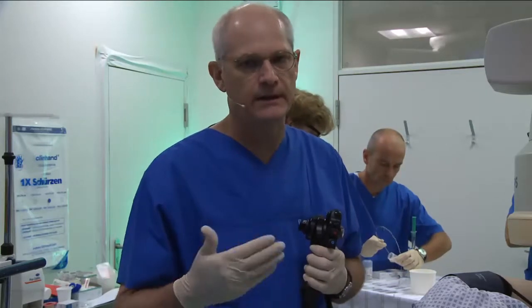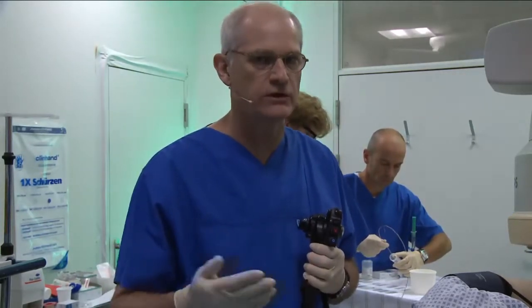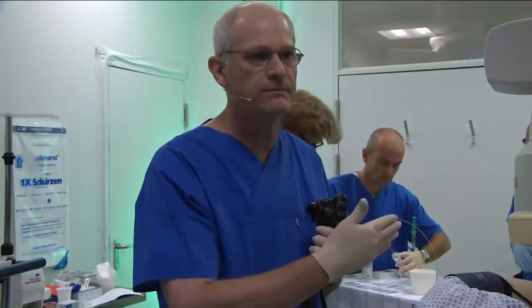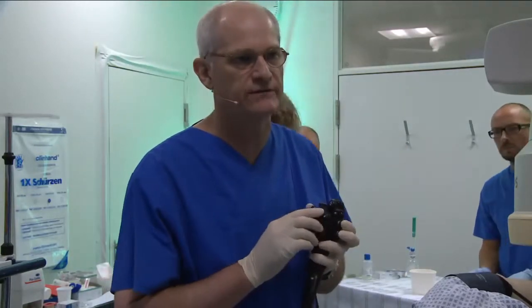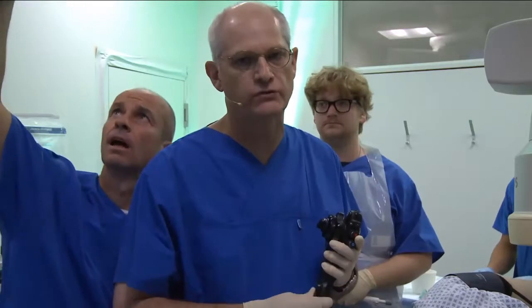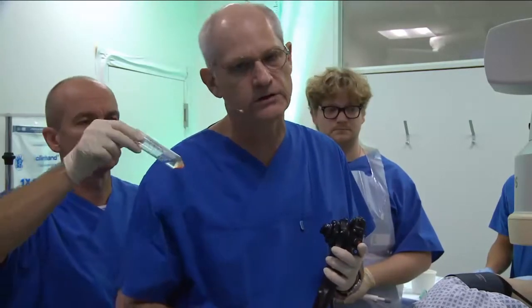For Thomas, they currently have a protocol going between standard needles and the ProCore needle, and so they may be doing something relative to their study in terms of the preparation of the material. Do you express it with a stylet, or do you push it out with a syringe? Do you push it out with some saline? Do you put it in formalin first?